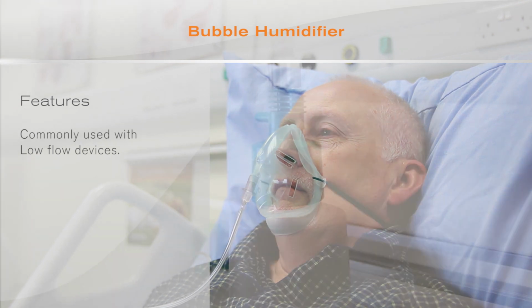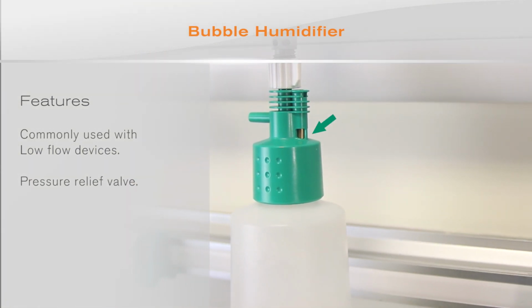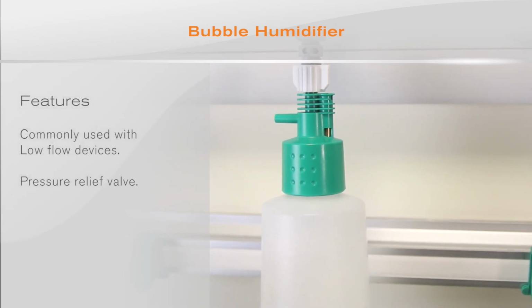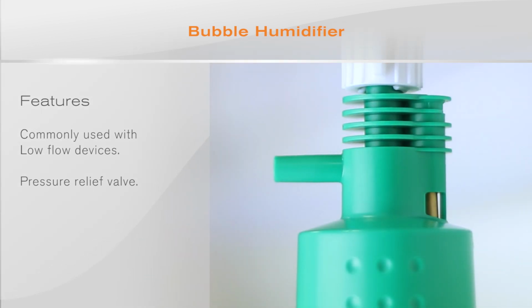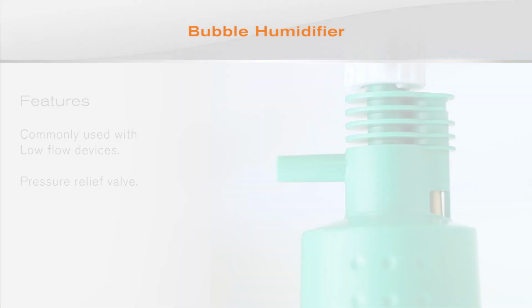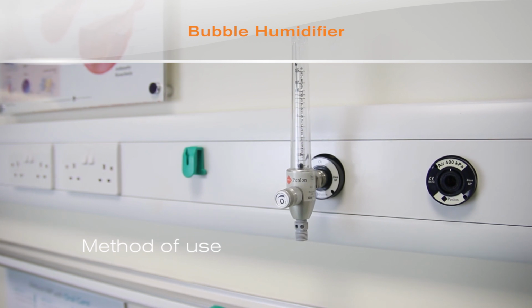Some models incorporate a pressure relief valve designed to prevent excessive pressures building up in the bottle should the oxygen tubing become occluded. Operation of the relief valve may also activate an audible warning, drawing the attention of the user to this problem. The flow meter should be attached to an appropriate oxygen supply.